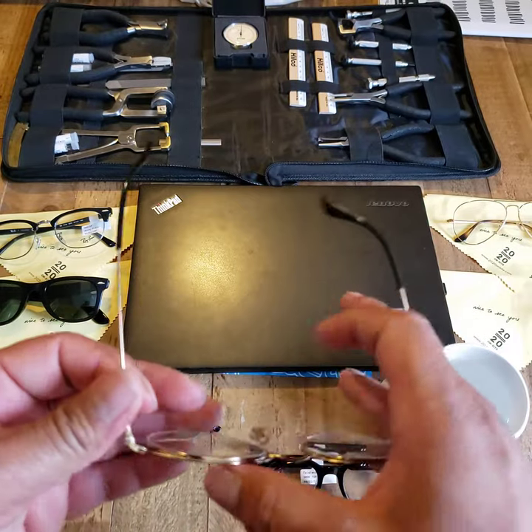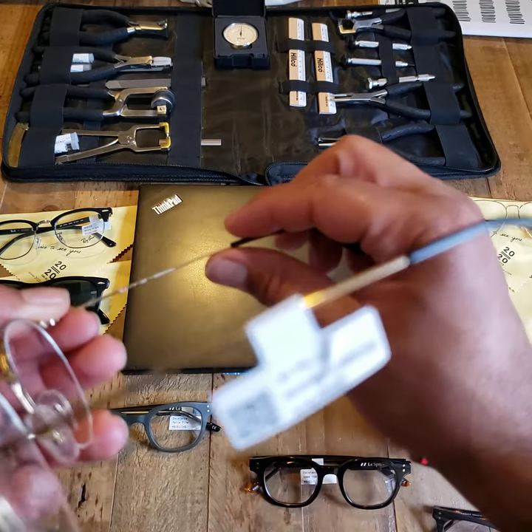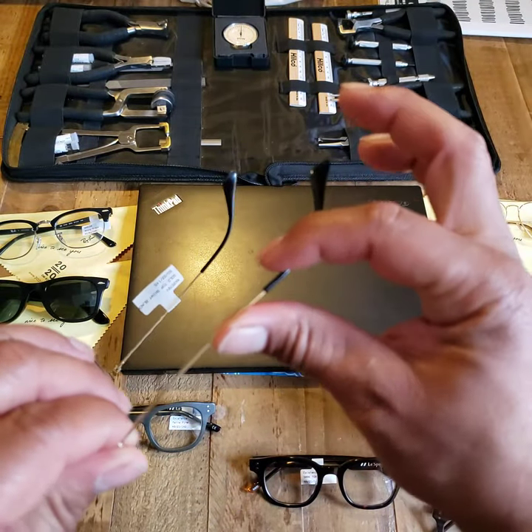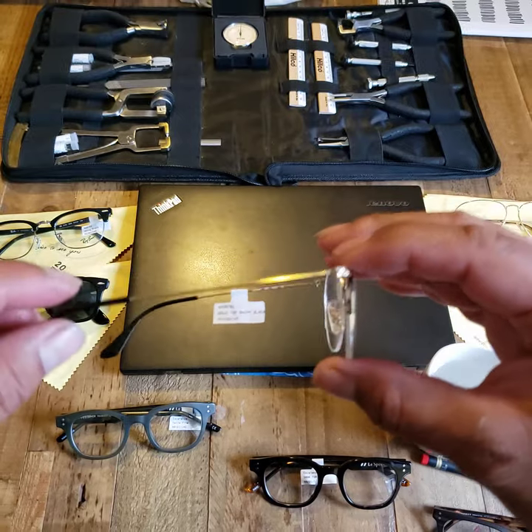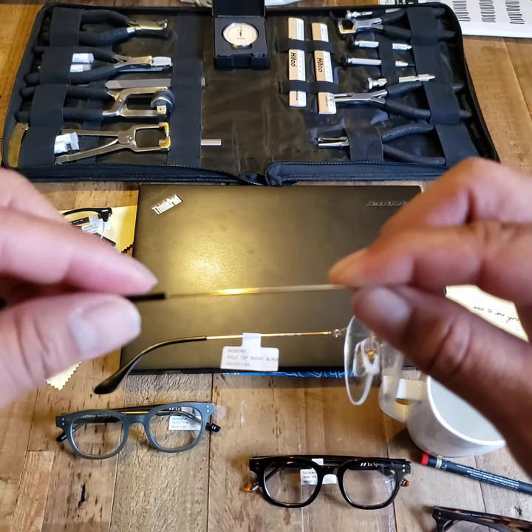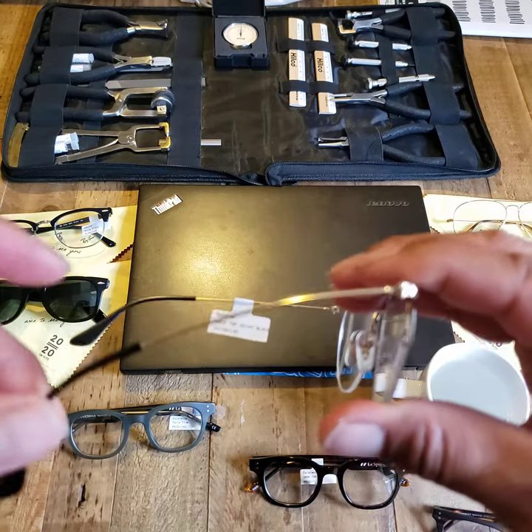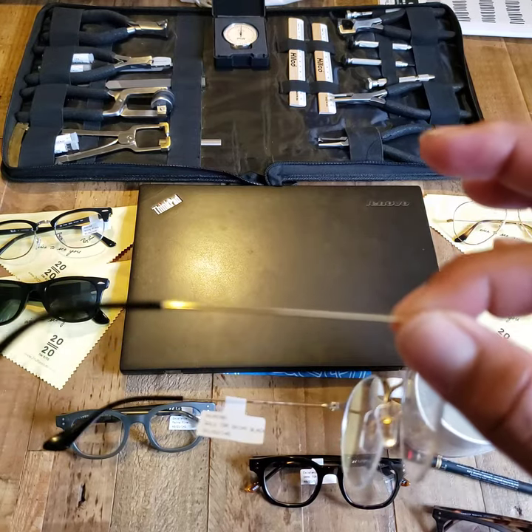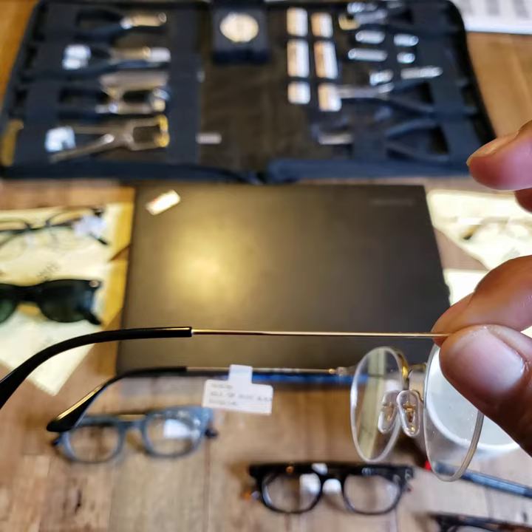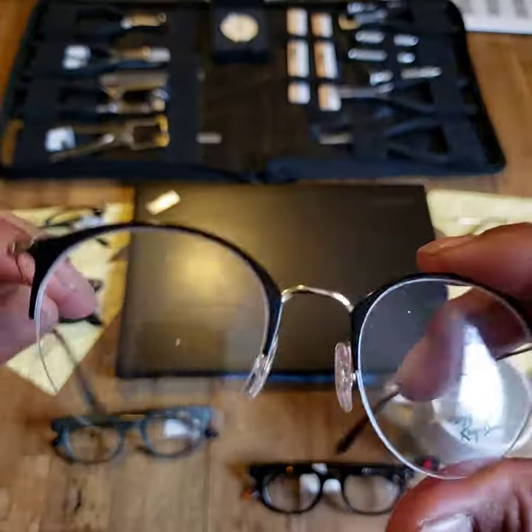In a metal frame, you get to skip right to the good stuff because there's no need to heat it up. I can already start to manipulate the temple down or up. You're never really looking to crank on the frame. With a very thin, malleable metal like this you can see it moves quite a bit. In other frames, just give it a little bit, hold it, let it set, and then try it on.